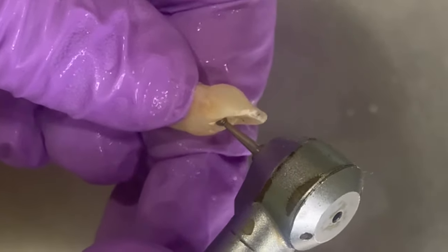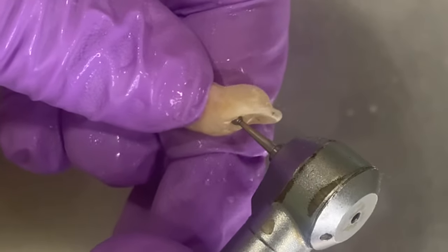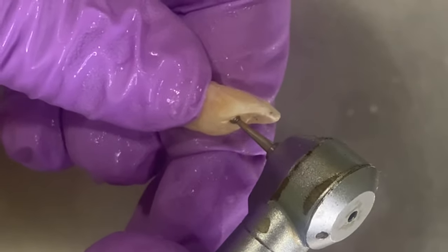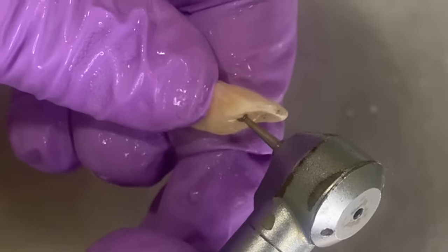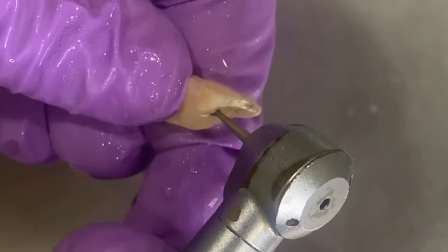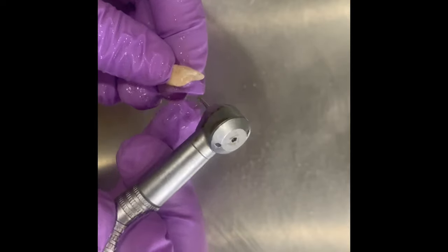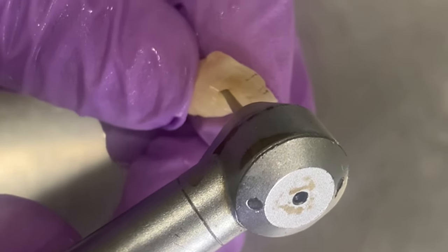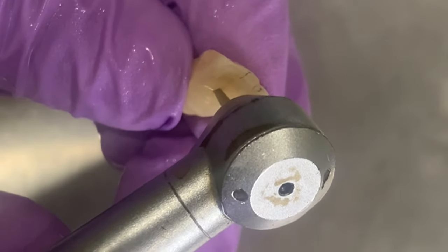This way the cutting is done with in and out motion. Now how do we know that the pulp chamber is reached? Well, you'll feel a drop of the bur into the chamber once we reach there.